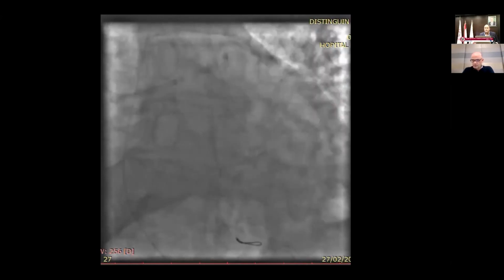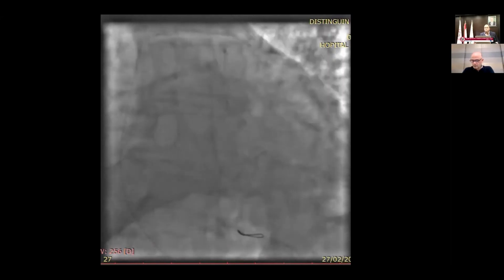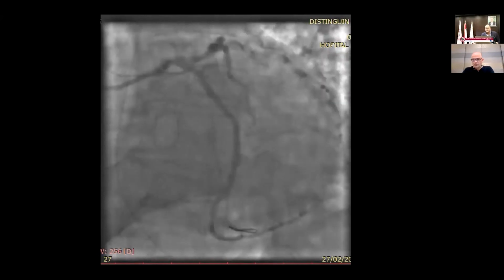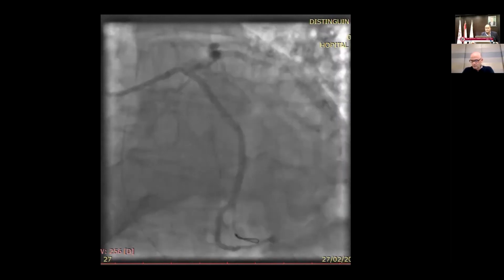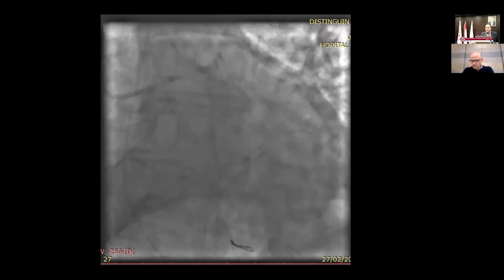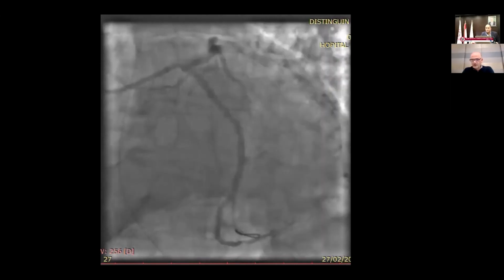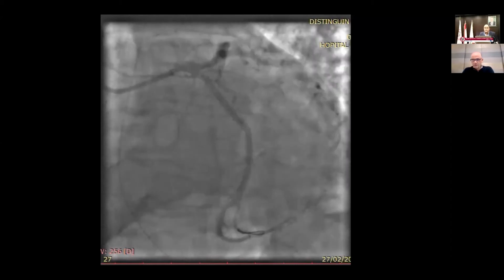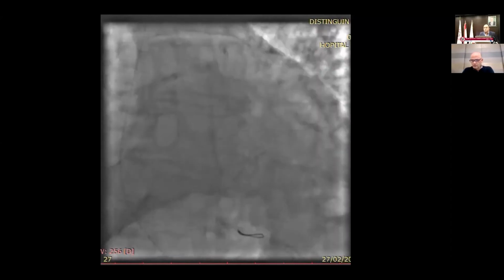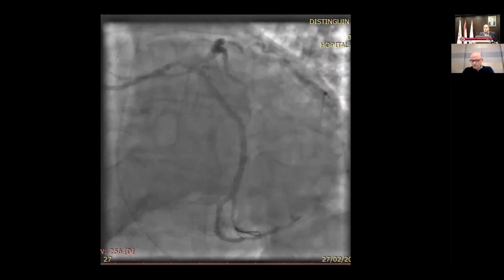But we think that the problem is not solved here. The patient was always in deterioration in hemodynamic parameters. The blood pressure was around 75/45 millimeter Hg. Although we inserted an intra-aortic balloon and treated the possible first culprit lesion, the patient remains in hemodynamic deterioration. So rapidly we want to take a decision. What do you think?